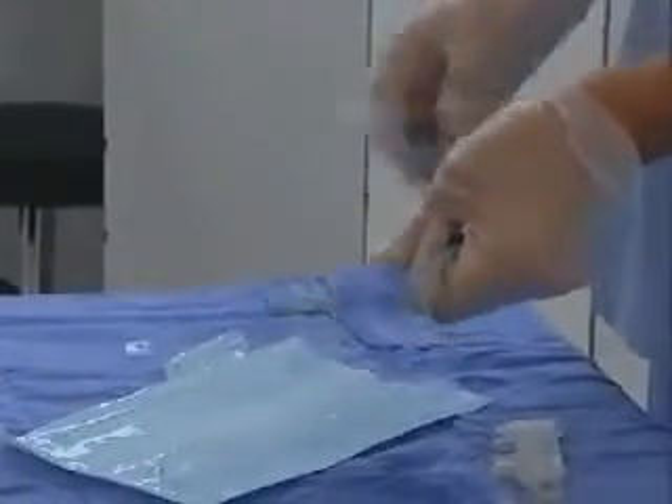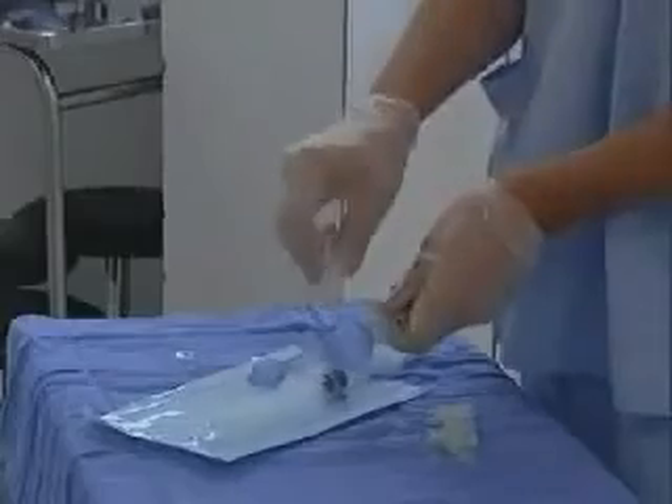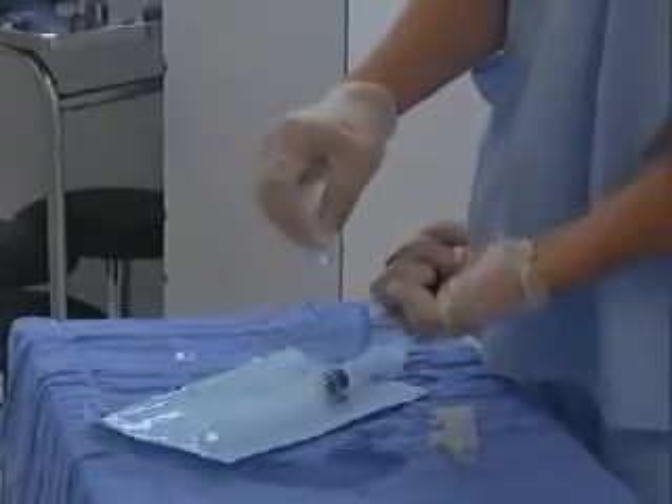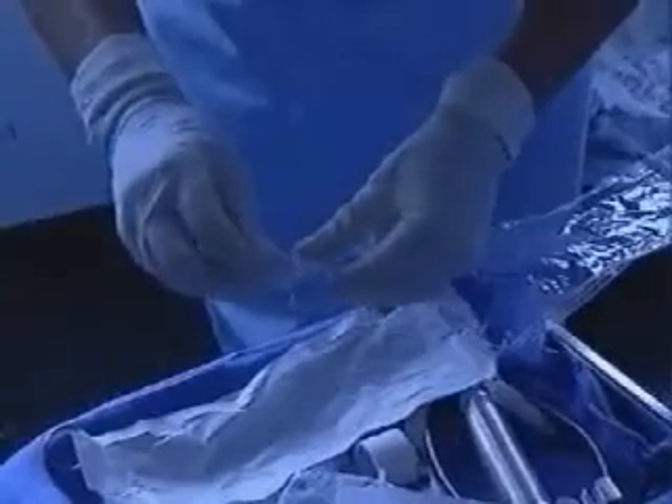Before insertion, both cuffs are completely deflated and previously lubricated with either sterile water or with water-based gels such as Johnson's KY.